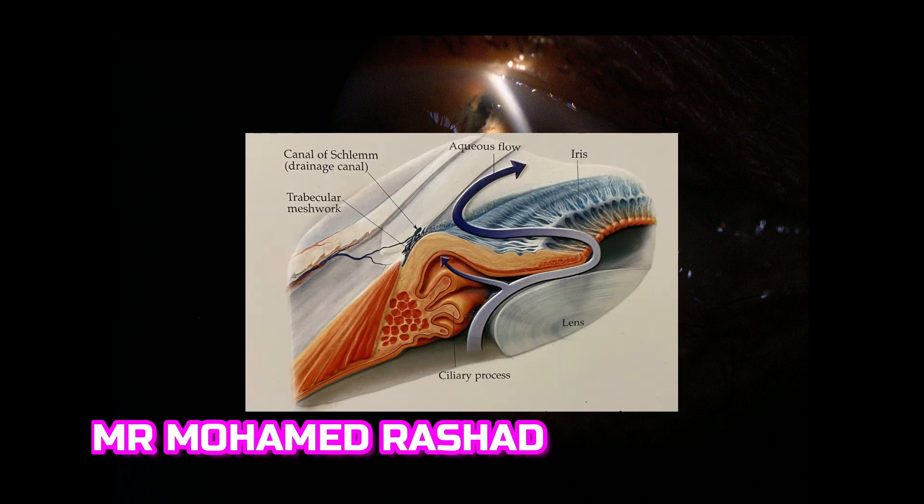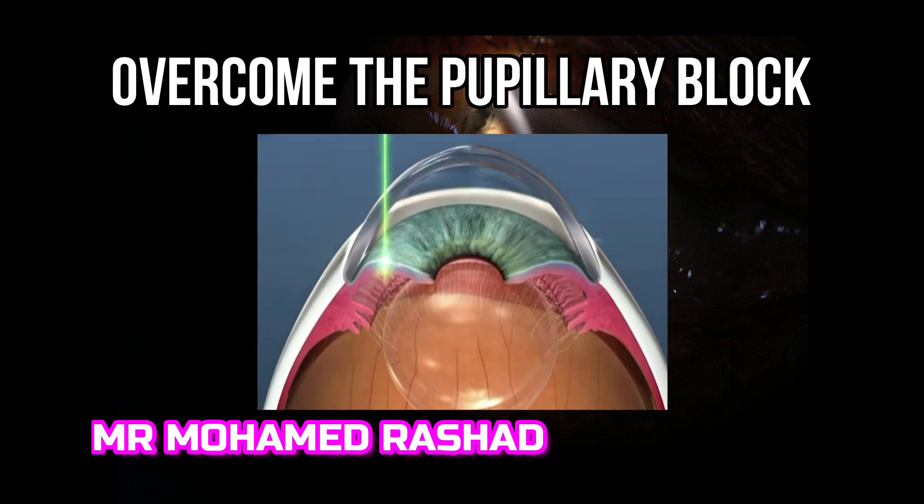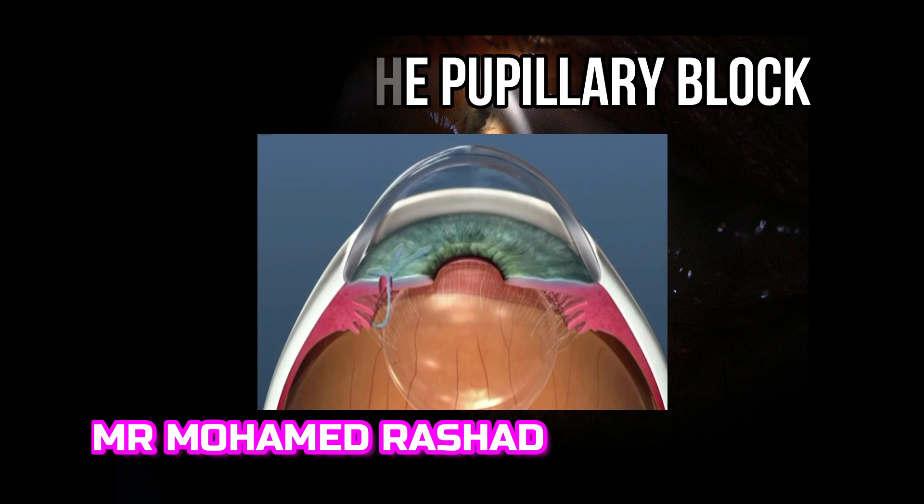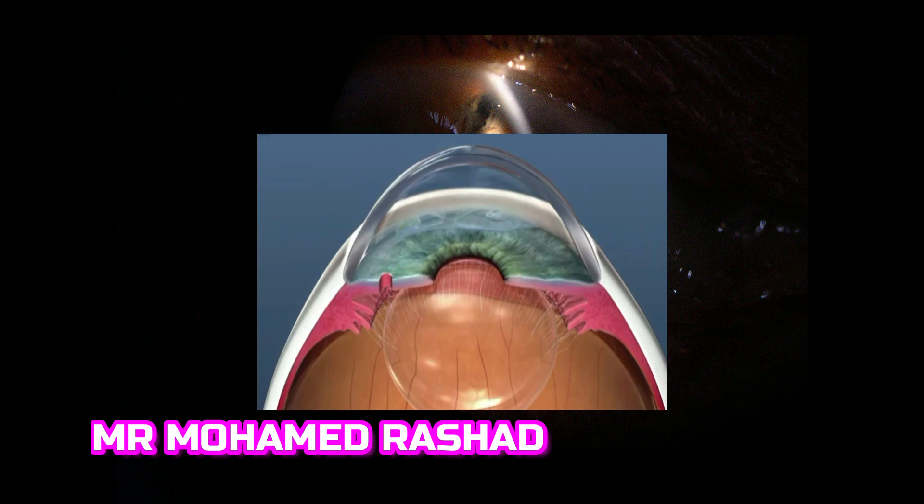The idea of the laser peripheral iridotomy is to overcome the pupillary block that occurs with angle closure. The laser creates an opening to communicate the posterior chamber with the anterior chamber, relieving the angle closure so the aqueous flows through the opening and releases the pupillary block.